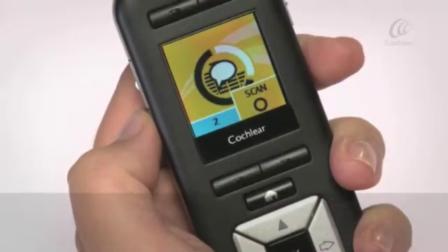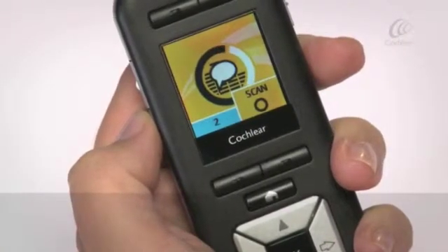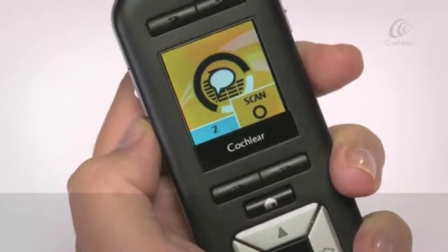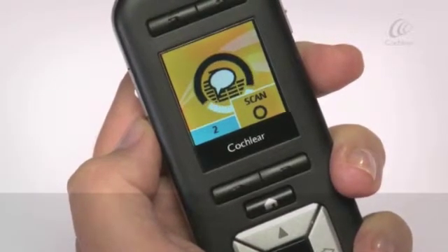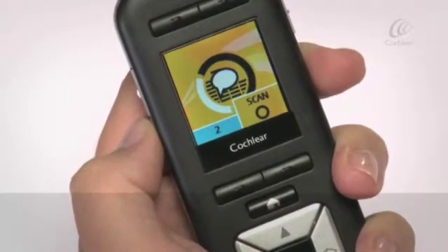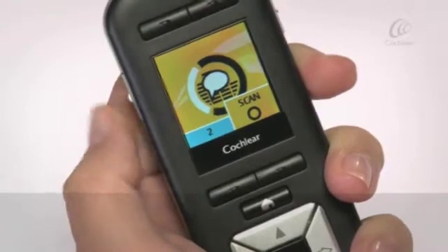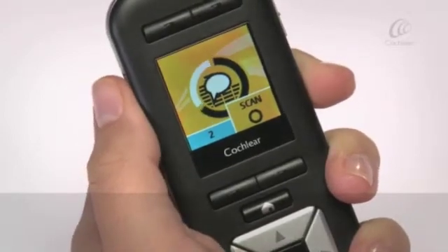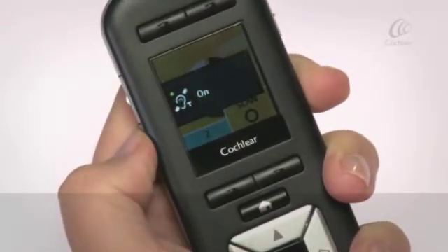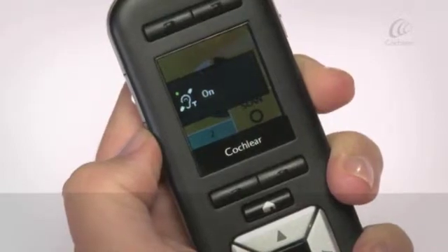When you use telecoil or auto telecoil, the following icons may display on your home screen. Telecoil on: telecoil is active on your processor.